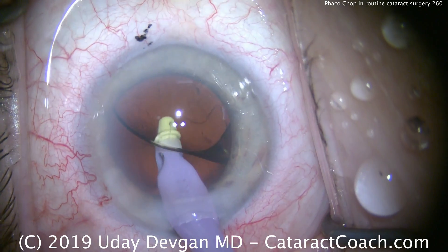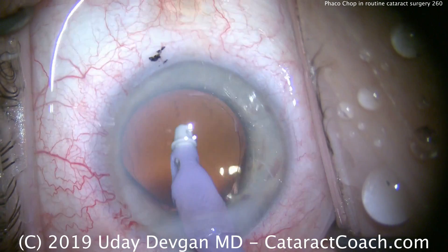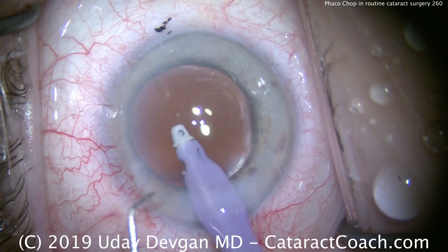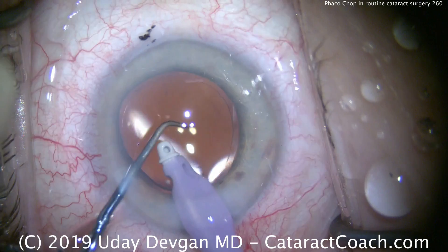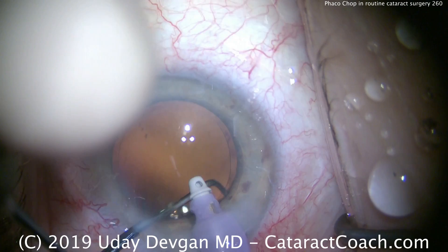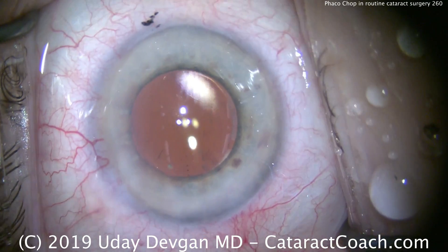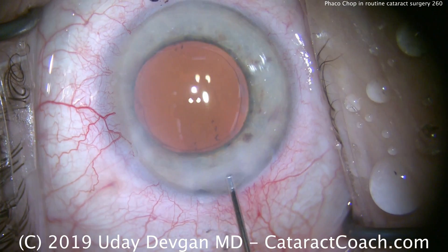Because once the IOL is in the bag, the edges of the IOL will all but disappear — and that is 6mm. Cleaning out all the remaining viscoelastic from the eye. You can see the toric lens marks. Just using our chopper here to nudge the lens over — it's already pretty well lined up. That looks great. I make reference marks at the beginning of the case on the cornea, so I just have to line up the lens marks with the corneal marks. We account for parallax by using the Purkinje images.